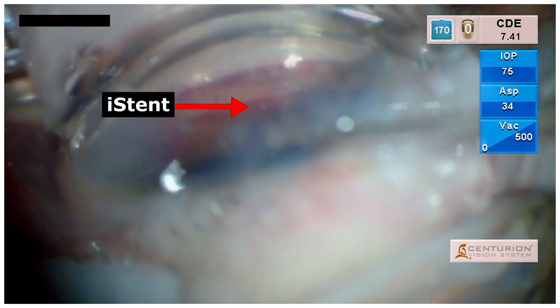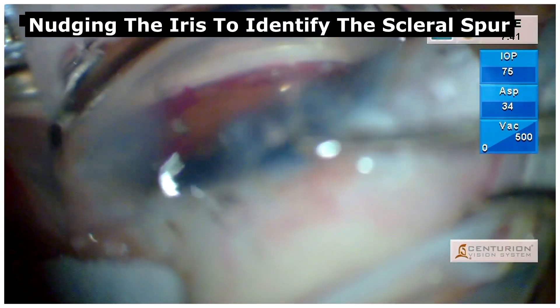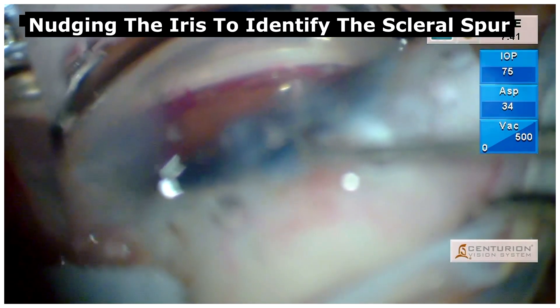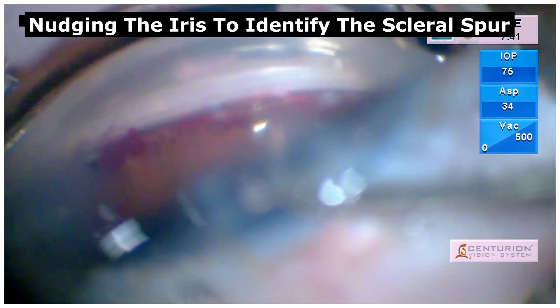In such cases, with slow and controlled maneuvers with the dialer as shown here, the iris can be nudged gently to identify the scleral spur and confirm the position of the iStent within the trabecular meshwork.